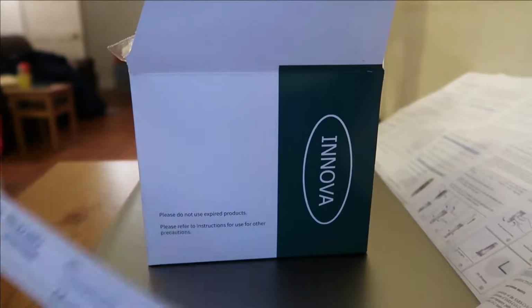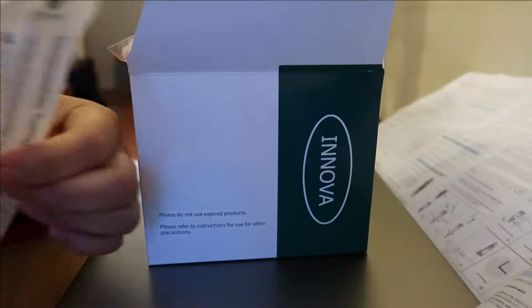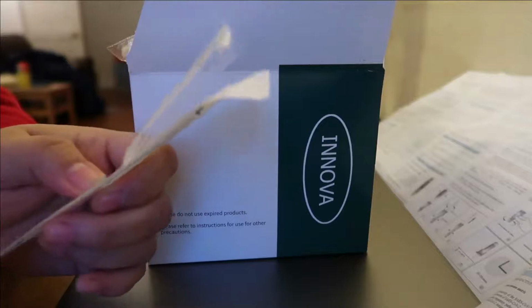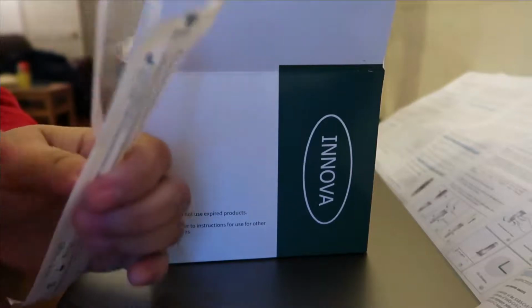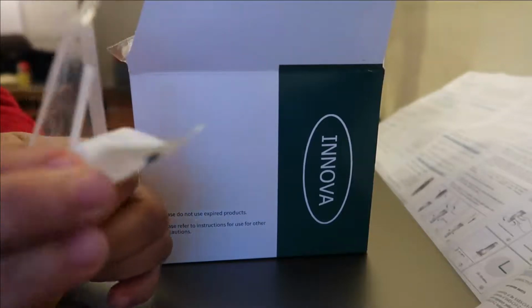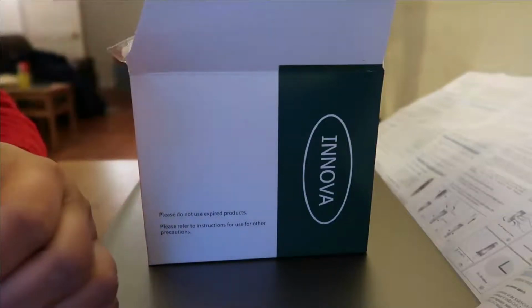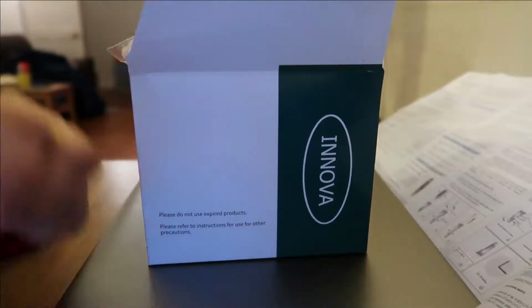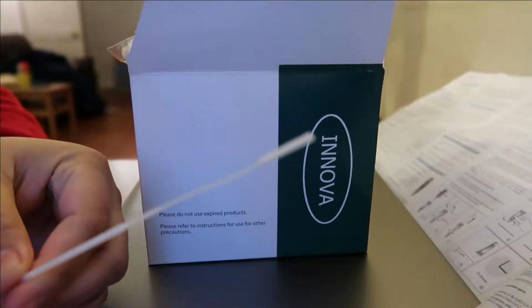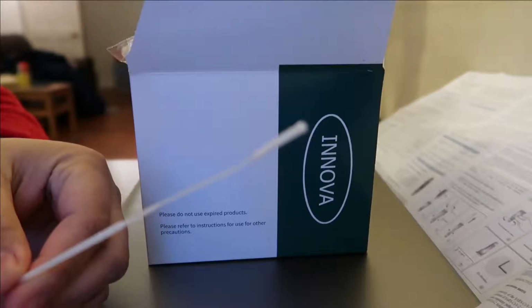Okay, so you peel this off. It's important you open it on the handle side, not on the tip where the swab is, because you shouldn't be touching the swab. Okay, if I pull it out, I should be careful not to touch this very end. This should only touch my nostrils where I will need to collect the sample.